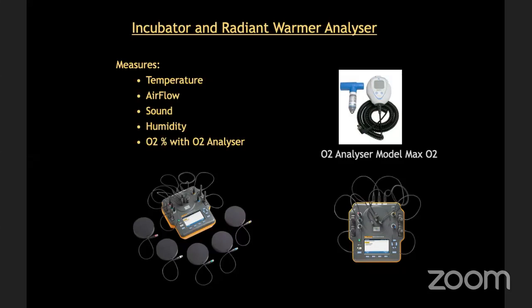You have to keep this test equipment inside the incubator, and you see there are around 5 temperature sensors, airflow sensors, and humidity sensors. Close the machine, set the value on the incubator, and check the value on the analyzer, whether the set parameters are achieved or not.